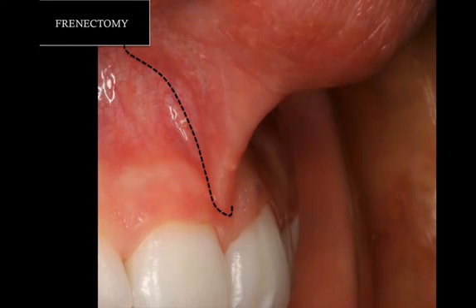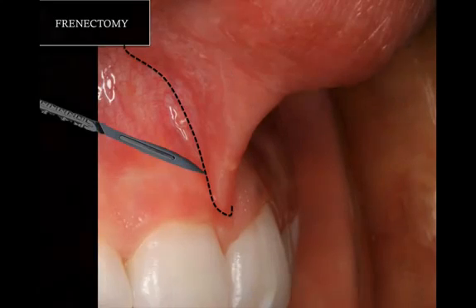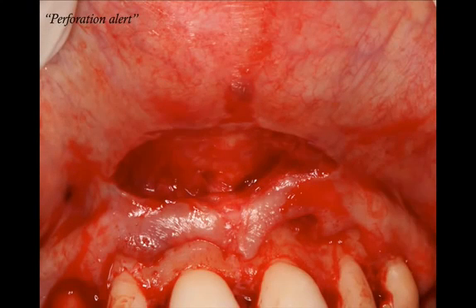Now, remember, we also have a frenum to resect. And the way the resection is going to work, we'll start from the part that is attached to the keratinized tissue and place our blade parallel to the attached tissue, and then resect it from the lip end right in here. Once you do that, you have a pretty large open incision. So you have to be very careful not to create a perforation right in there, because you're perforating your flap. You can create some necrosis problems, and I wrote down there's a perforation alert. You've got to be very, very careful.